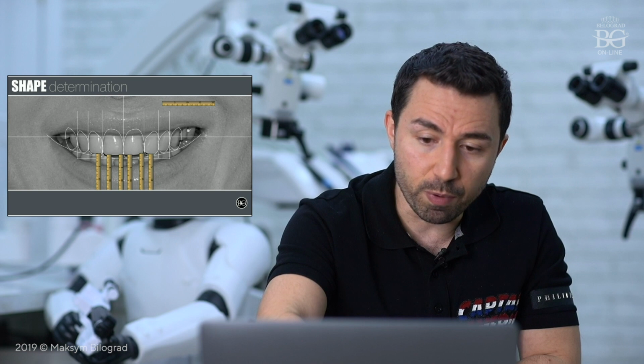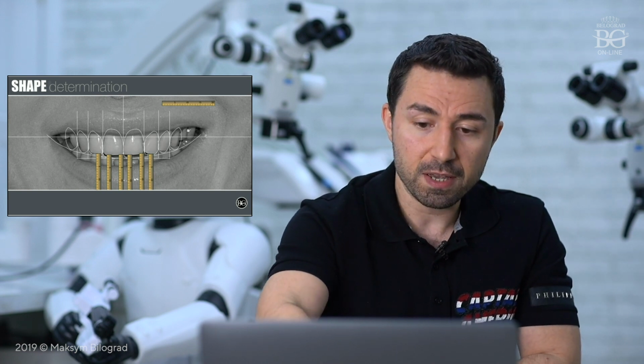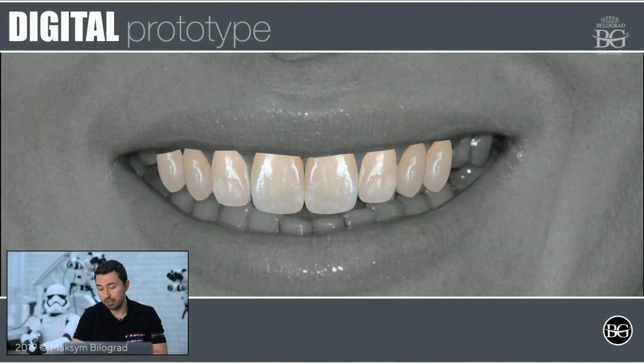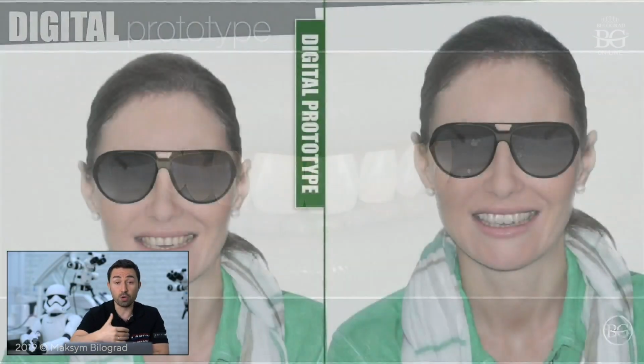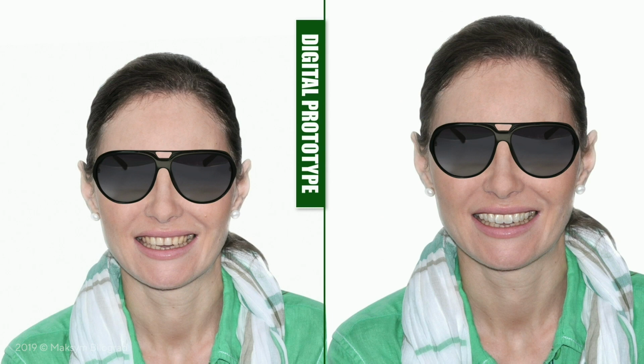So the aesthetic component was based on smile design. We also made a digital prototype within the first consultation to show to our patient and also to ourselves, to understand if that kind of design will be okay for the patient or not.